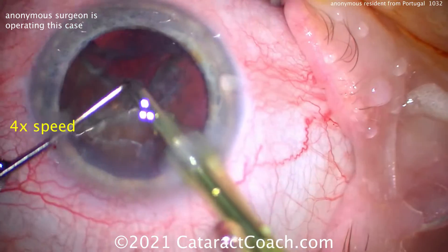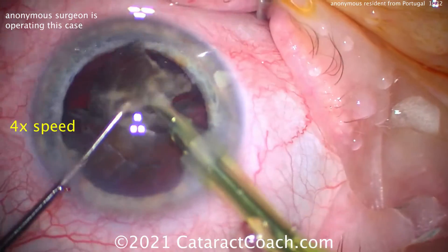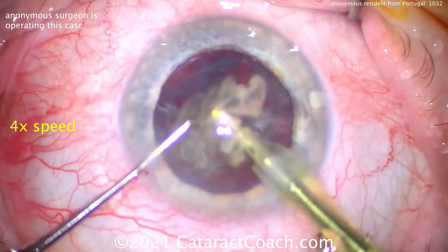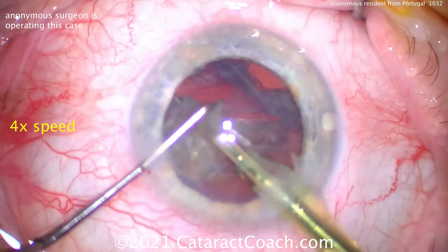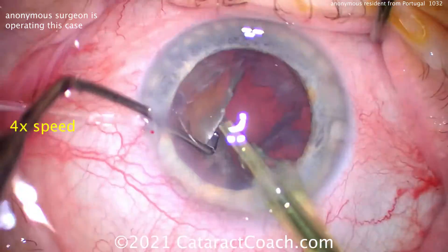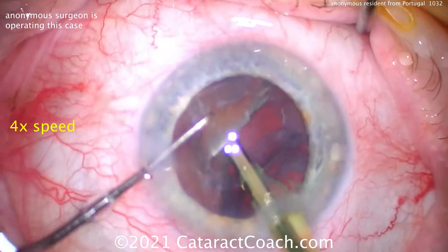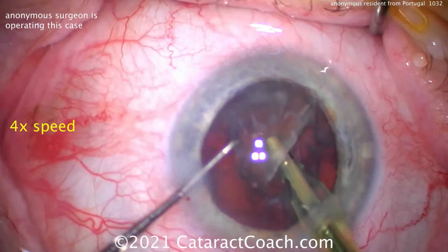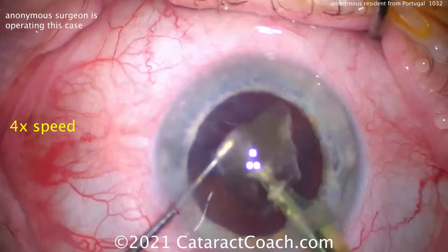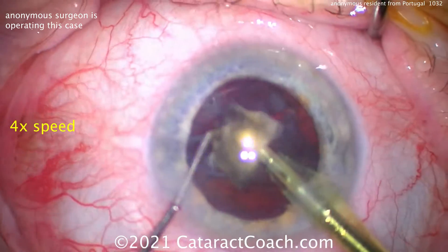Nucleus removal is going fine — I like the technique, looks pretty reasonable. Good pivoting there to rotate the nucleus. Another sub-chop at the iris plane — I like it. Let's take these down; we've got half a nucleus remaining in the capsular bag. Let's rotate it again, then buzz the FACO probe in. It's going to be at least 400 or 500 millimeters of mercury vacuum, and then there's the chopper, and it can break the piece. You notice that the chopper doesn't have to go way around the equator — you can do a combo chop or vertical chop here.